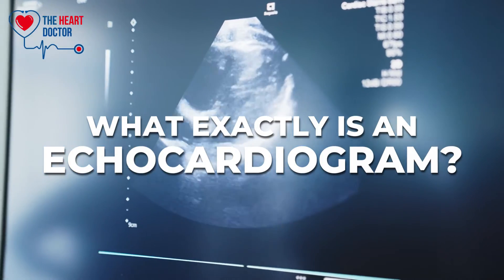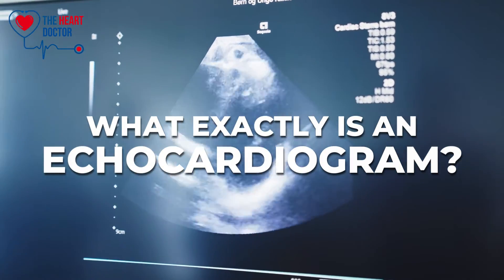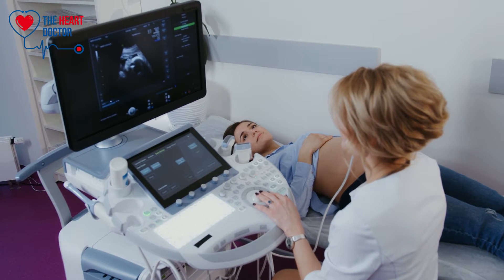Let's now get straight into the topic. So what exactly is an echocardiogram? An echocardiogram, commonly referred to as an echo, is a scan of your heart. It's like the ultrasound scanning used in pregnancy as it uses sound waves to build up a picture of your heart. The type of ultrasound used is specifically designed to visualize your heart and its structures.